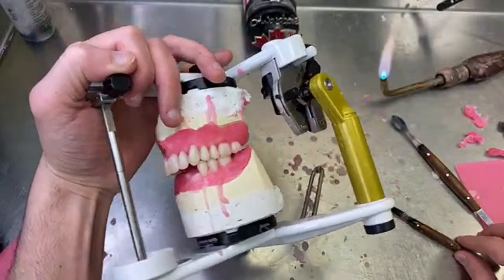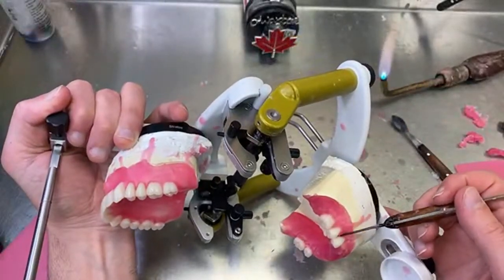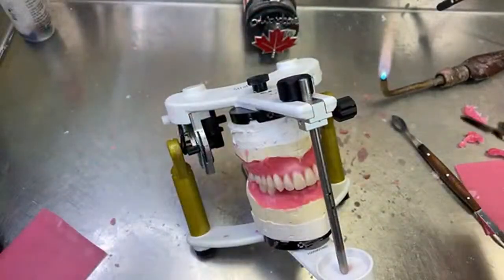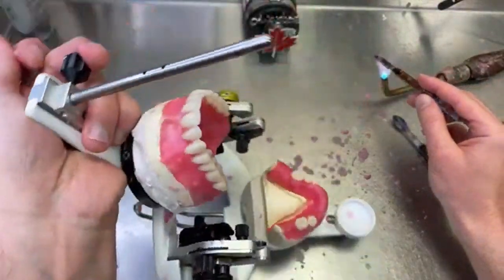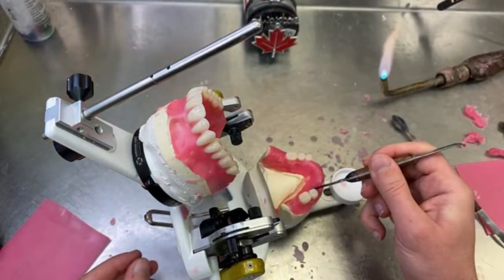There is your molar here. Premolar, and the other premolar is here, and we're almost done.